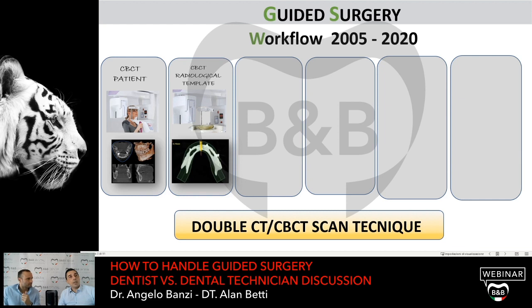Well, in this case, it is important. If you want, you can use a light curing base and bring it into contact with the antagonist teeth to achieve stability. The best thing usually is to use a prosthesis.